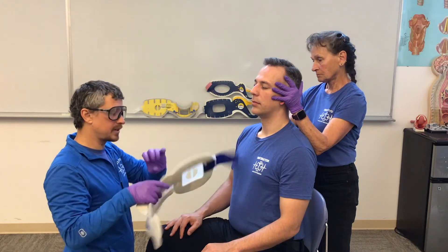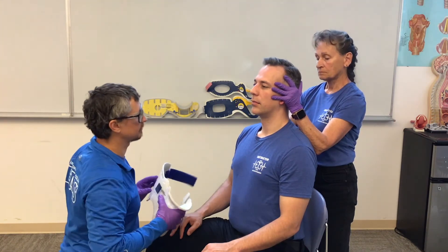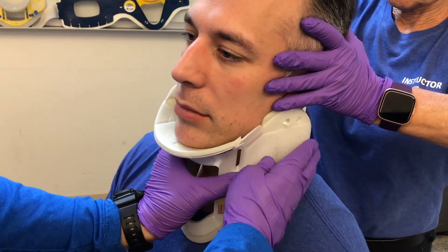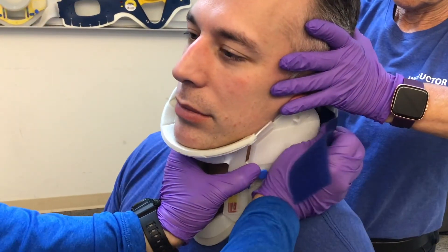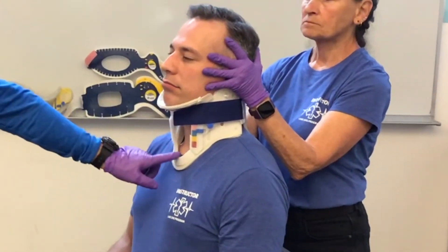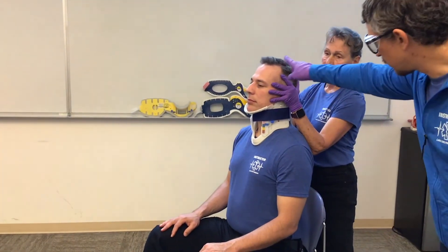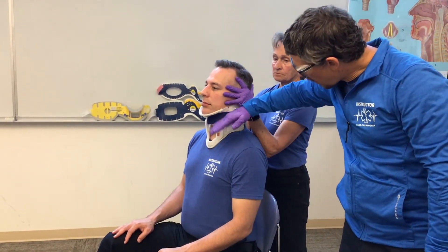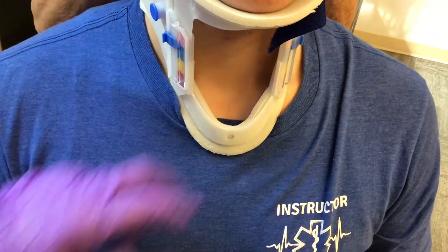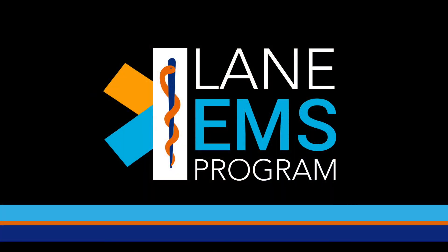I'll need to bend my collar a little bit to help mold it when I put it on my patient, because when it comes out of the packaging it's going to be nice and stiff. As I put this on my patient, I'm going to work with Sue to get this underneath her arms, around the back of my patient, and velcro that in place. I want to look to make sure that my collar is in line with the midline of my patient. I can step over to the side to look to make sure that my patient isn't hyperextended or underextended, and that I don't have a large gap between the base of the collar and the sternum.